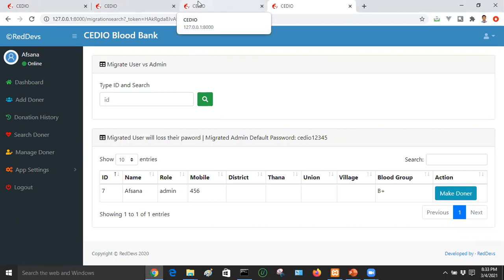If you have a blood donation, you can view the full history — individual records and total history. If you have a donor, you can search by reason, phone number, ID, and more.